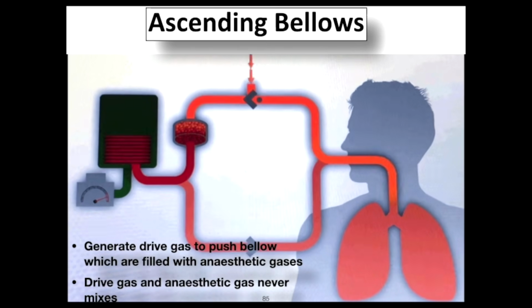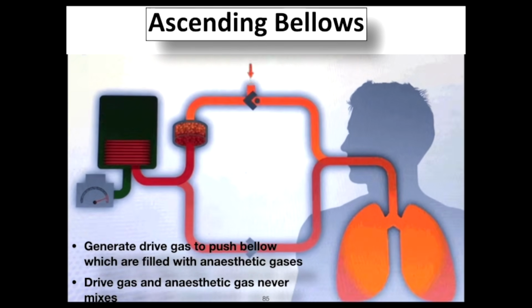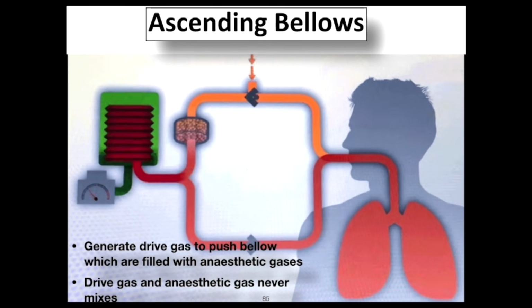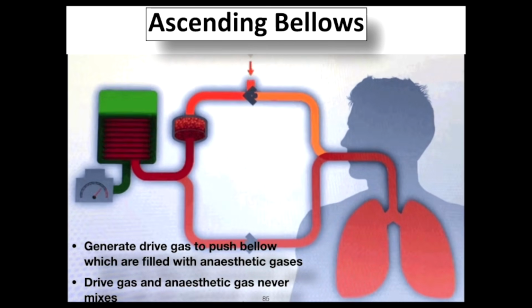So drive gas pushes the bellow. Drive gas and anesthetic gas do not mix here. The drive gas is different, and it is released into the atmosphere, while the oxygen, air, and sevoflurane, whatever you are using, goes inside the bellow.